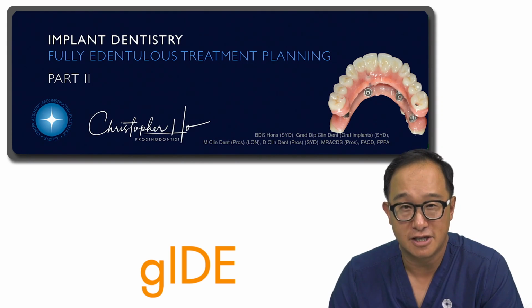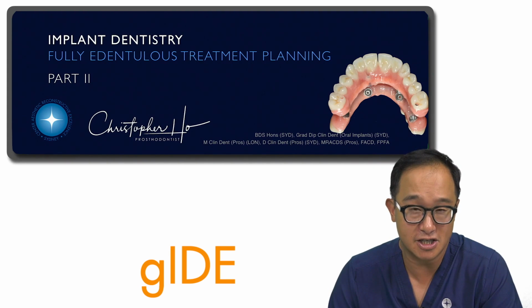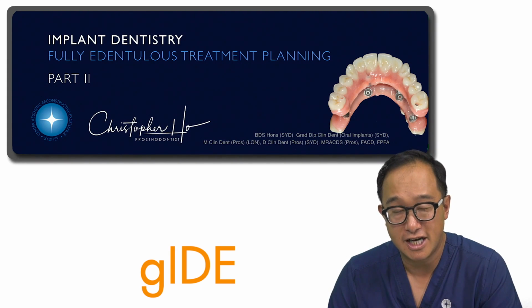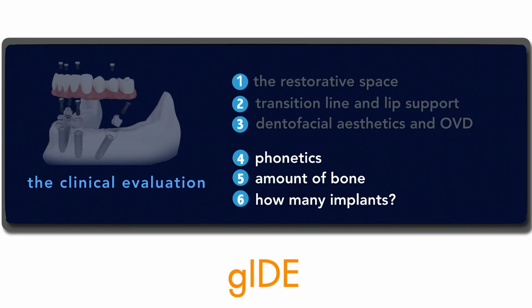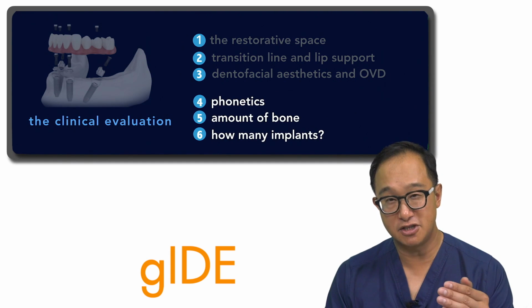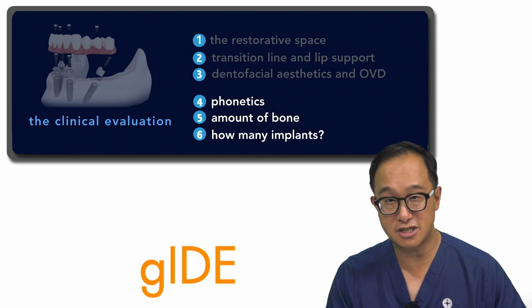In part 1, we focused on some of the restorative space requirements. We talked about the transition line and the lip support, and also about the dentofacial aesthetics and vertical dimension. In part 2, we're going to talk about the phonetics, how we set the teeth so that patients can enunciate and pronounce words correctly. We'll show you some of the different determinants which allow you the positioning of the teeth for vertical dimension and the height of the face.